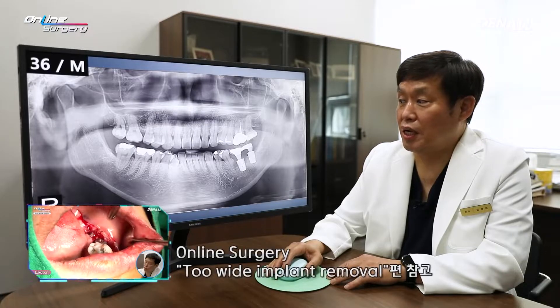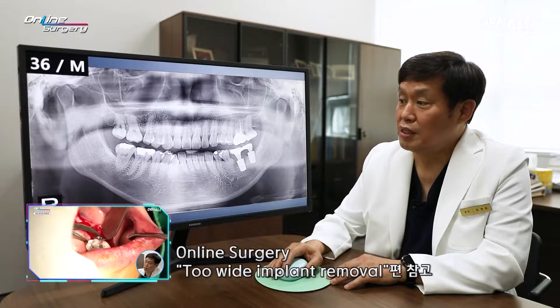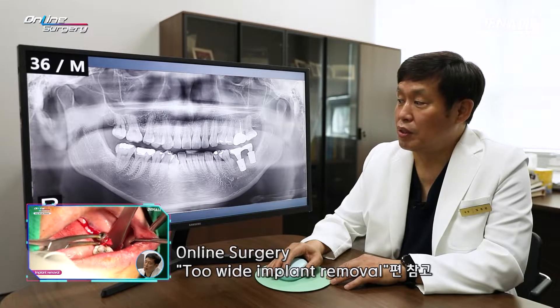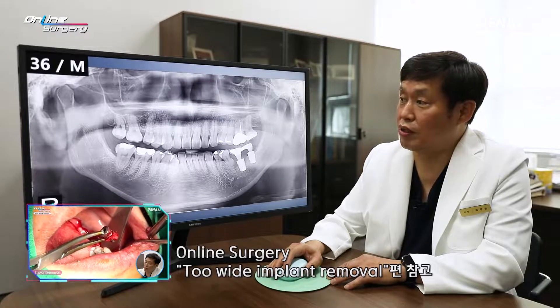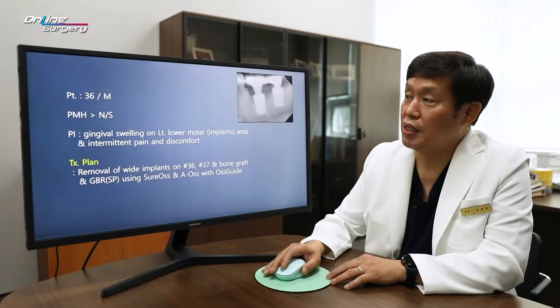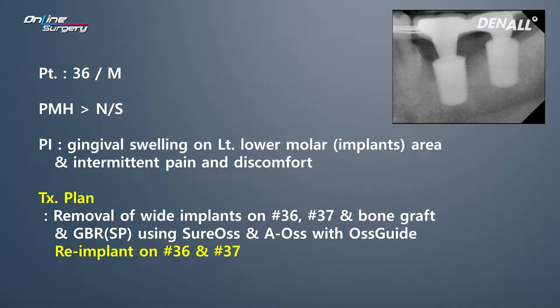This is the same patient I showed you in January — a 36-year-old male patient. Because of wide implants placed earlier, the patient's chief complaint was peri-implantitis. At the time there was constant gingival swelling. Two implants were removed, and 7mm and 8mm GBR — a type of socket preservation — was done. SureOss and A-Oss were used in a layered manner, and OssGuide was used for GBR.